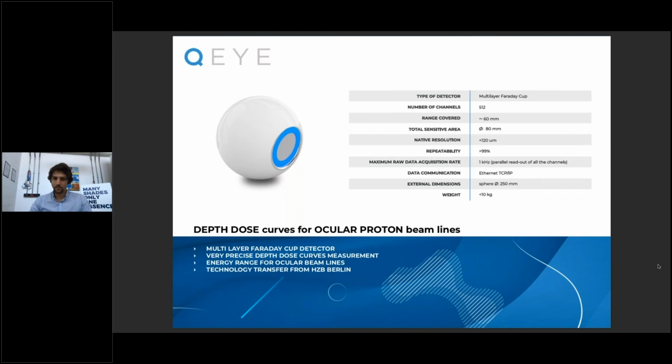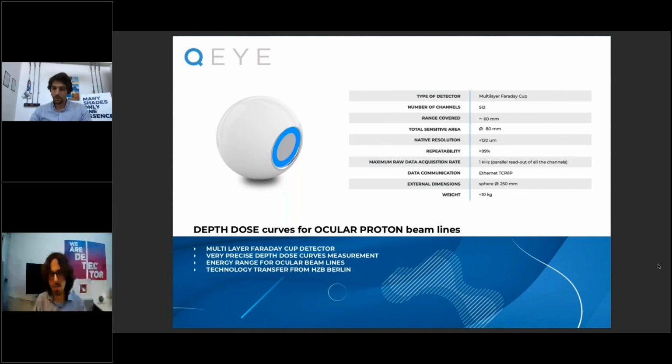Okay, then another one, will it be possible to modify or add new algorithm for the analysis? Yeah, I think you mean in HiQ, of course. It will be possible in version 2.0. As I described before, we are developing this integrated development environment to give you the possibility to create your algorithm and include it in the platform.